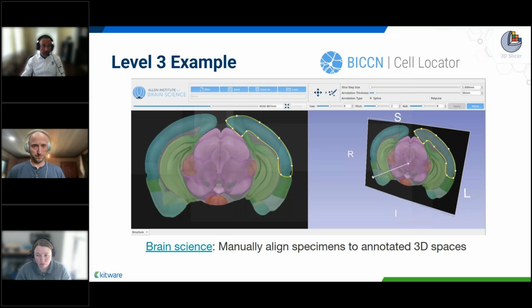So I guess it depends. If you're making a tool for internal use, for example something to help process your own data or make your own internal decisions, a custom Slicer module that you can just drag and drop into existing 3D Slicer would be ideal for an internal tool.